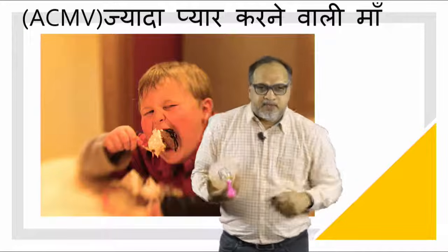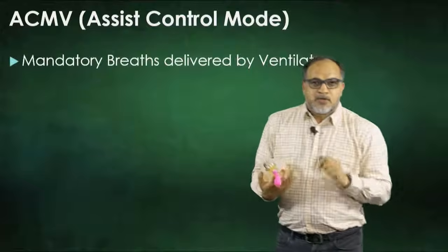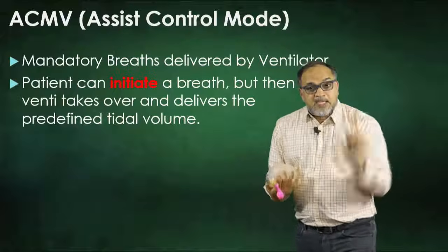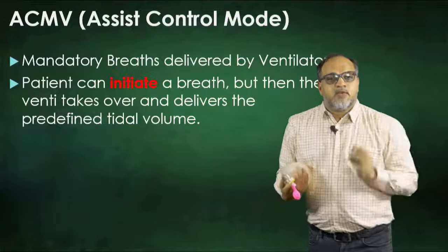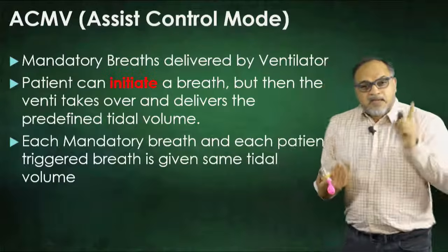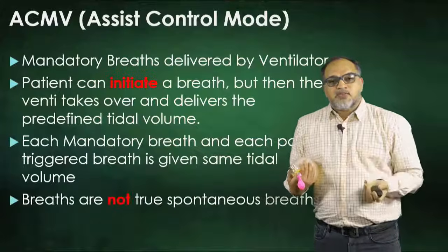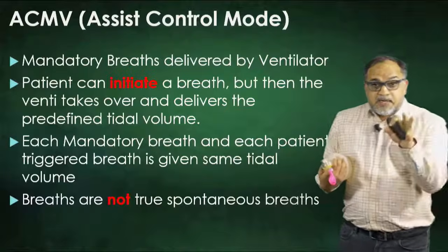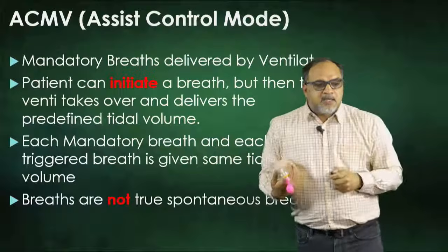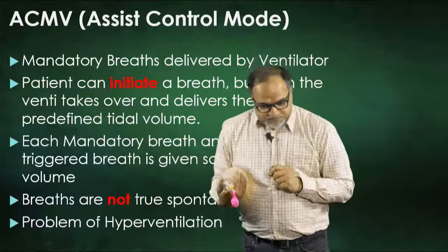So let's go further. This mode was also having its own set of problems. In assist control mode, mandatory breaths were delivered by the ventilator and the patient could initiate a breath, but then the ventilator will take over and deliver the full predefined tidal volume. Each mandatory breath and each patient triggered breath is given the same tidal volume. Eventually, the patient will hyperventilate, and these are not true spontaneous breaths because the patient is just triggering. Other than that, the ventilator takes over, and the problem of hyperventilation comes.